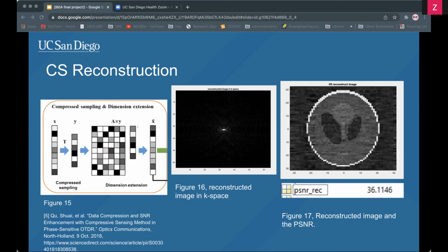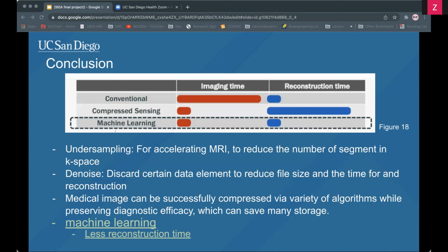So some post-processing methods should be applied to it, such as the soft threshold or total variation. The total variation should be applied to denoise our images. In conclusion, compressed sensing provides a new approach to reconstruct an image that's similar to the original image with time saving, for it accelerated the process of MRI by downsampling the original image. Besides, it reduced the data we need to store as well.